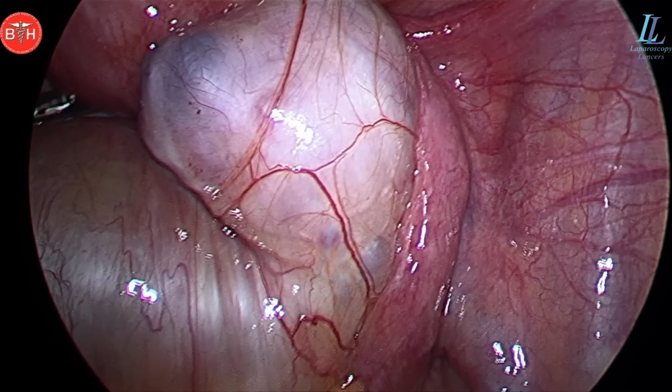Endometriosis and endometriotic cysts. In a case of primary infertility, a 27-year-old lady symptomatic with discomfort, pain, and infertility. There you can see a supraumbilical camera port, two ipsilateral working ports, 5 mm ones, and that's the right ovary. You can see the fallopian tube stretched out, and that's a cystic structure that looks like a chocolate cyst, and the uterus has been lifted up using a small uterine manipulator, and there you can see the left ovary hidden behind. So what will be the plan?